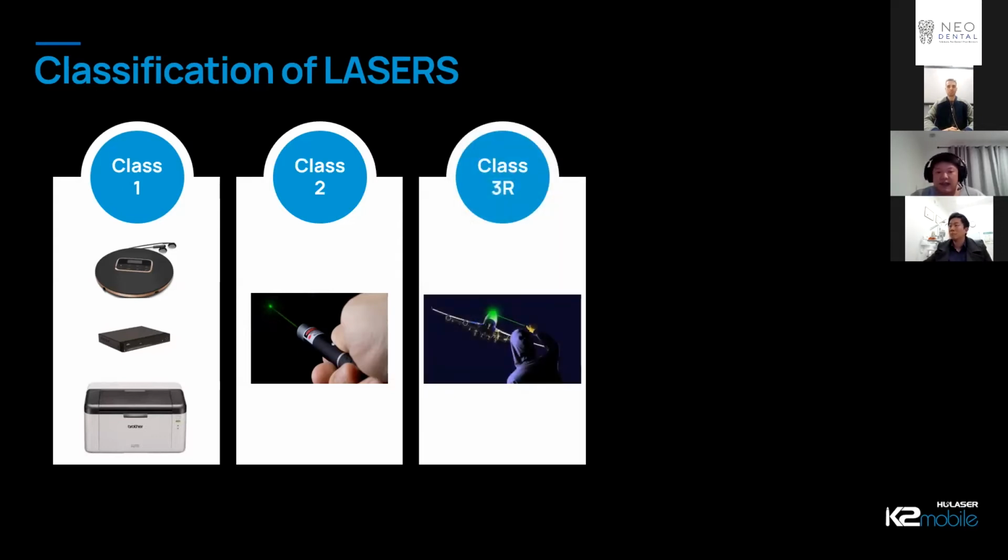A class 3R laser is just a much stronger and bigger laser pointer. Under certain conditions, they can actually produce spot blindness. Think about if you look directly into the sun, everything turns very bright and your vision takes a while to come back. It's very similar. In some countries like the USA, it's treated as a weapon, and if you're caught firing one of these lasers at aircraft, it's a heavy fine or jail time. So we're getting into the more heavy-duty class lasers.